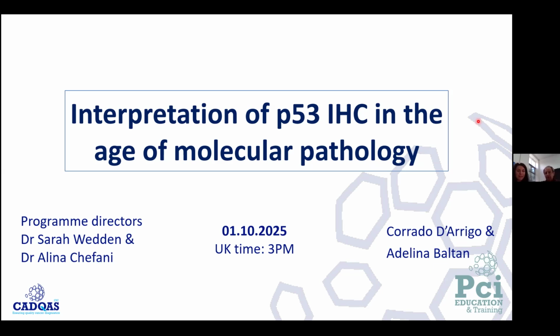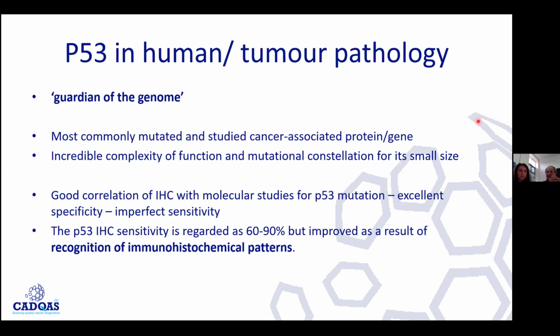We thought different things about P53. We had different antibodies that hit different bits of the molecule, and nobody really understood very well why sometimes it was staining, sometimes it wasn't staining. We will touch upon that because there are antibodies that bind different sites. So this will be interesting to see.